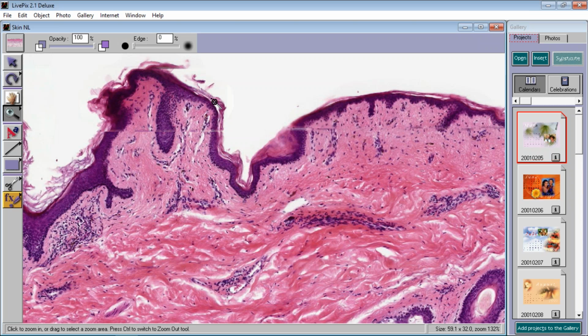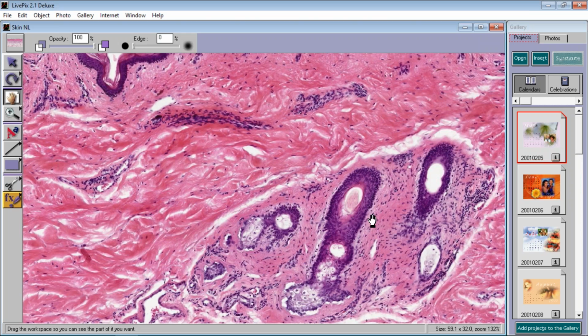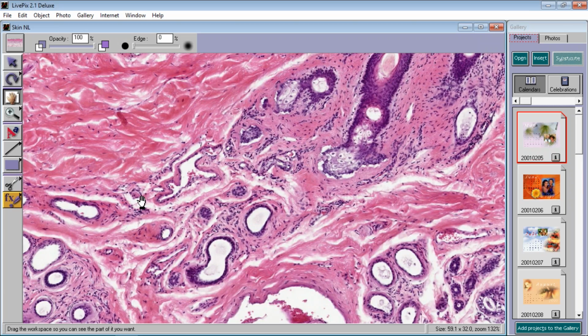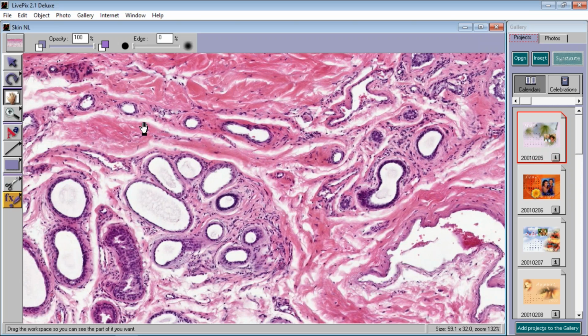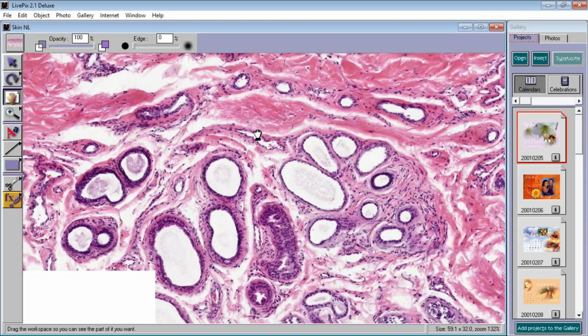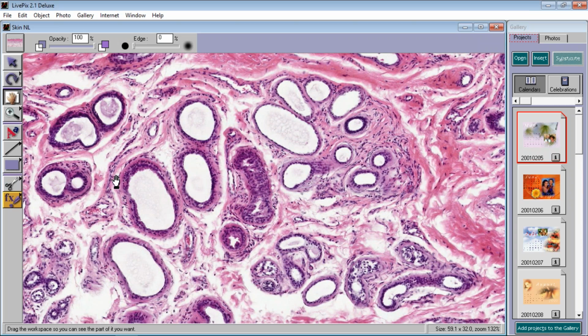We have a keratinized, stratified squamous mucosa. So that already makes it suspicious for skin. Now, in addition, we have hair follicles, and the hair follicles have sebaceous glands at their base. And in addition to that, you might be able to find some eccrine sweat glands. Oh, that could be the duct of one, but these sweat glands that you see here are apocrine.